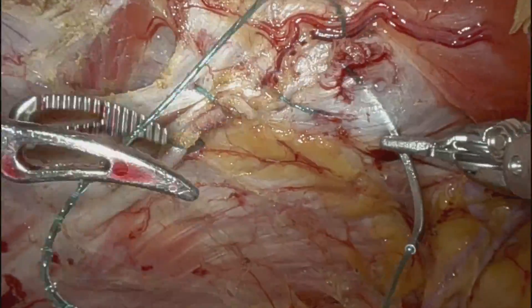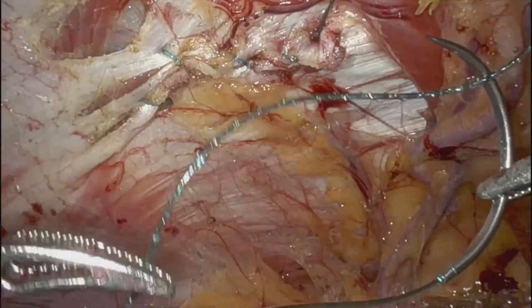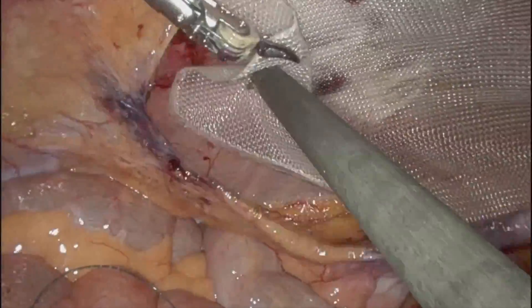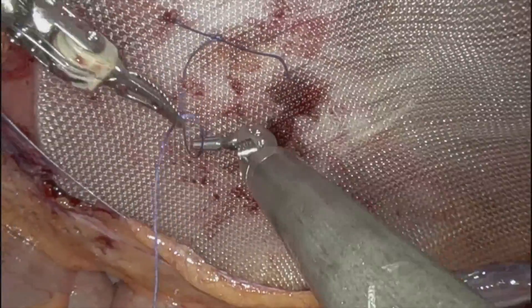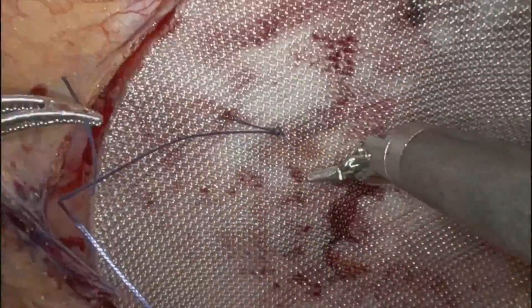So I'll just close the defect, as you can see. The mesh fits perfect. For spigelians, I do circumferential fixation — 4-quadrant fixation around the defect.